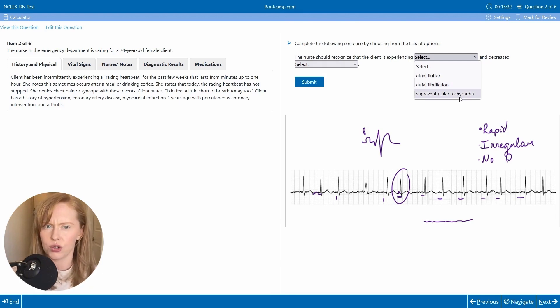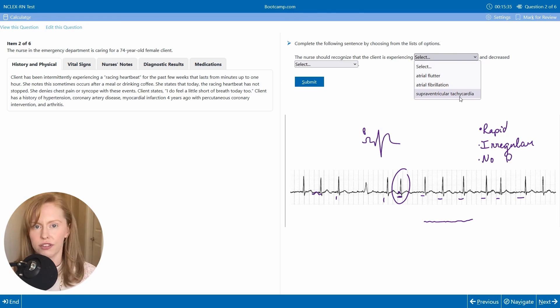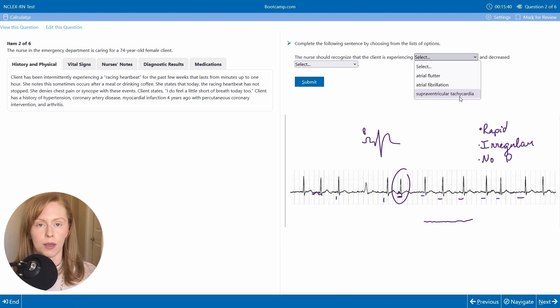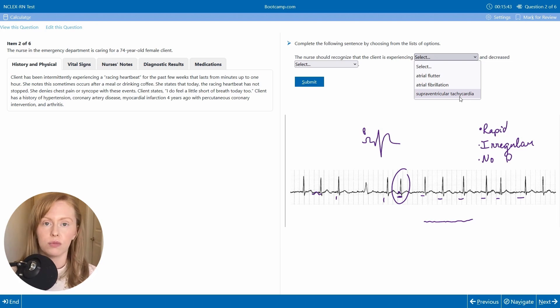Is it a supraventricular tachycardia? In a supraventricular tachycardia, you also don't have discernible P waves, but this rhythm is usually much faster and much more regular.